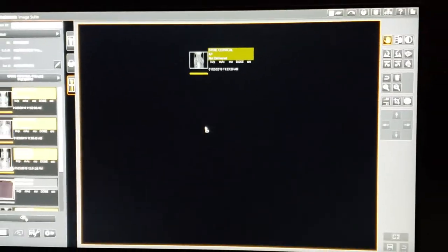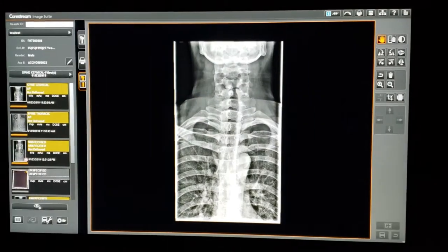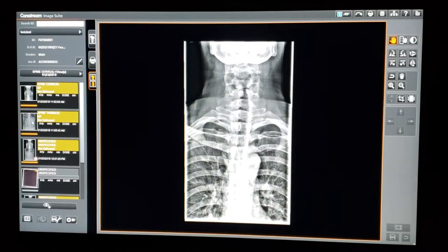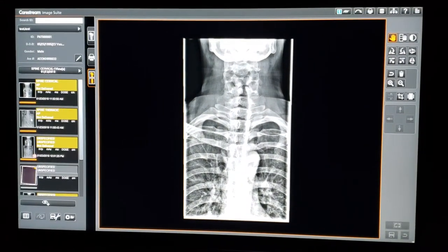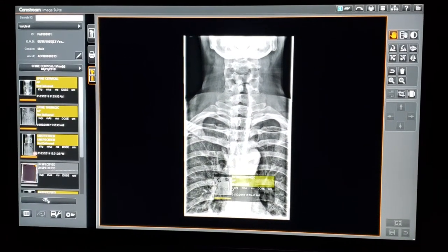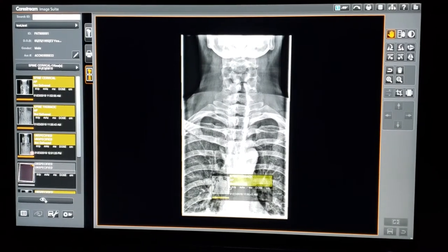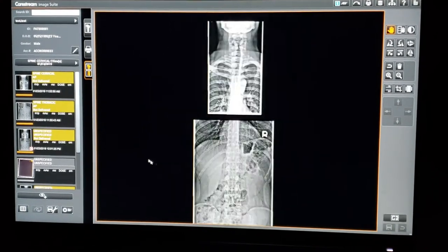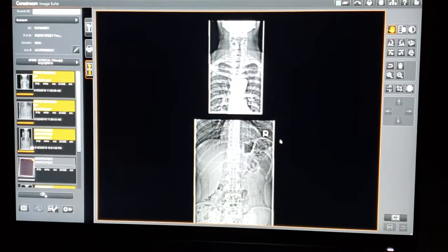At this point you're just going to left-click and hold and drag each image into the viewing area that you would like to stitch together. There's our cervical thoracic, here's our thoracolumbar, and it'll drag the images in.